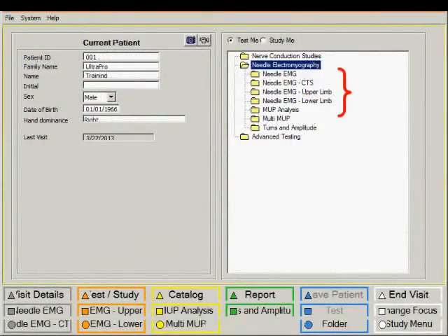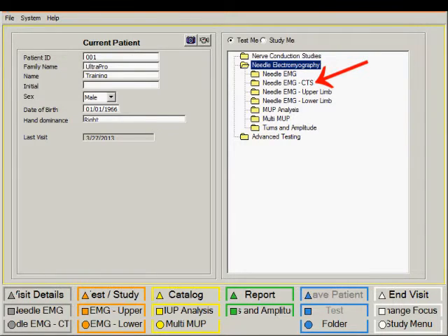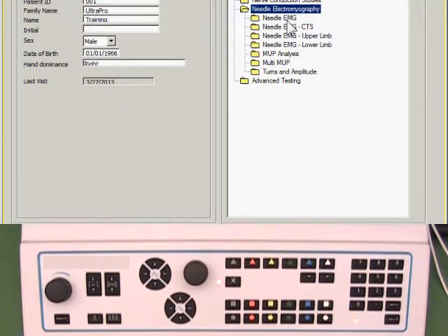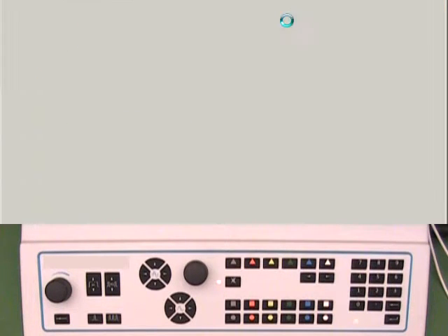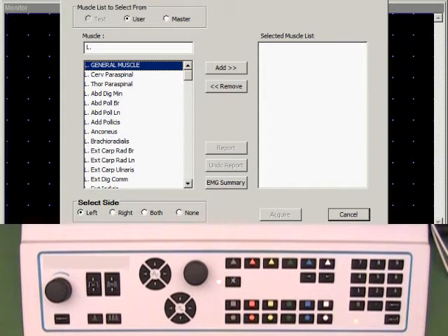The needle electromyography folder contains many test settings to perform the needle EMG examination. They are identical in functionality. They differ mainly in the preference of the muscles tested. The needle EMG CTS contains muscles that would be used for carpal tunnel syndrome. Let's start the needle EMG study.